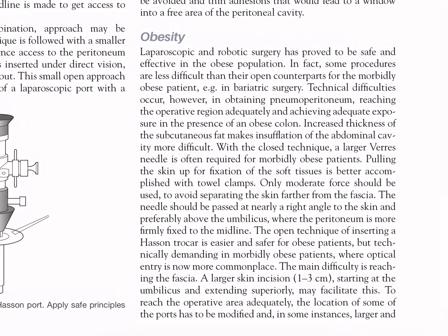The main difficulty is in reaching the fascia. A larger skin incision, 1 to 3 cm, starting at the umbilicus and extending superiorly may facilitate this.